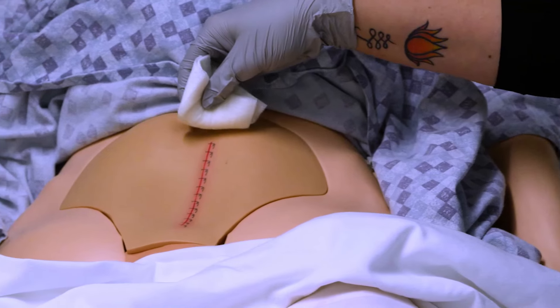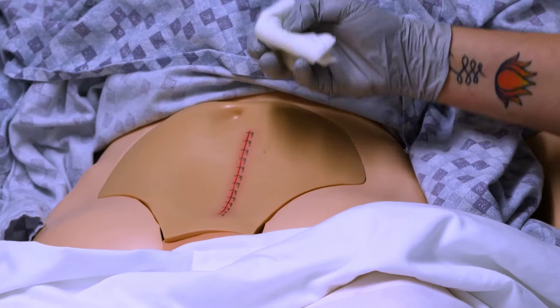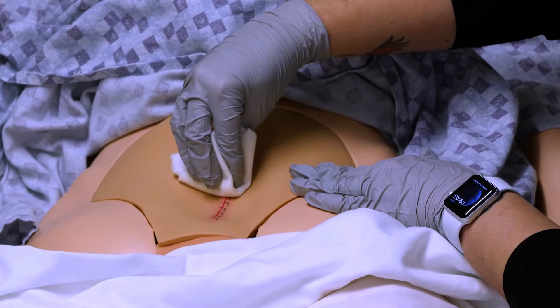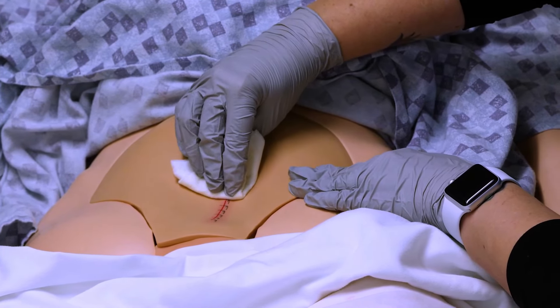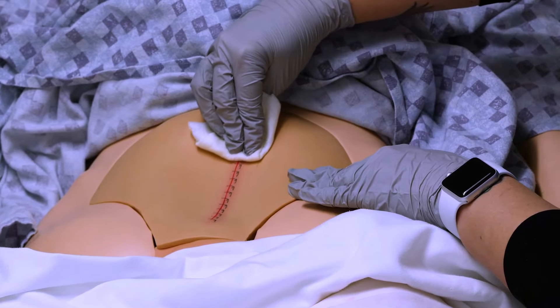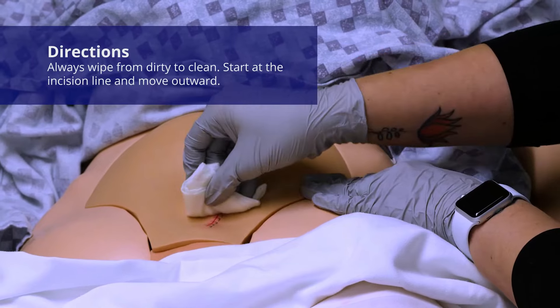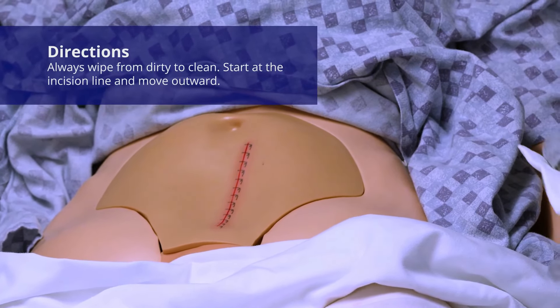I don't want to do this kind of back-and-forth motion, because then I'm dragging germs back in. For this kind of dressing, you can really just make sure that your incision is kind of midline, and clean this direction, and then clean this direction. There are a couple of different ways you can do that and still be totally safe.